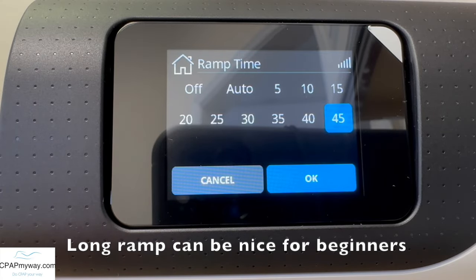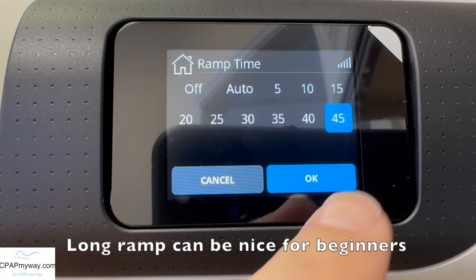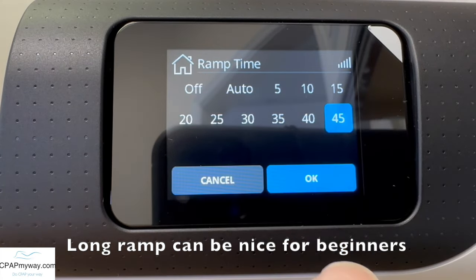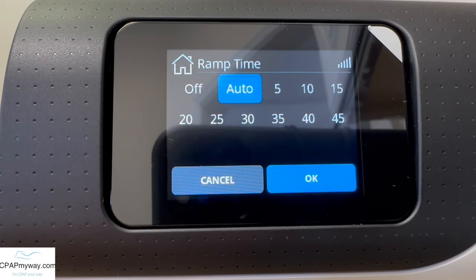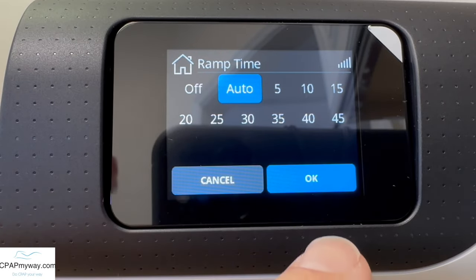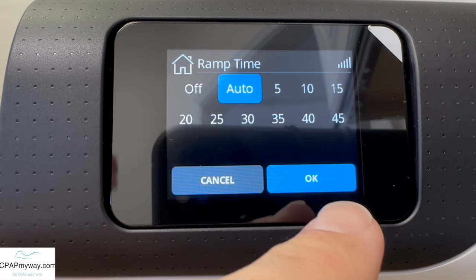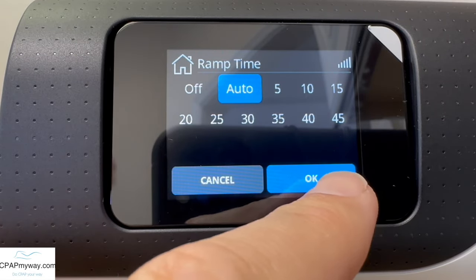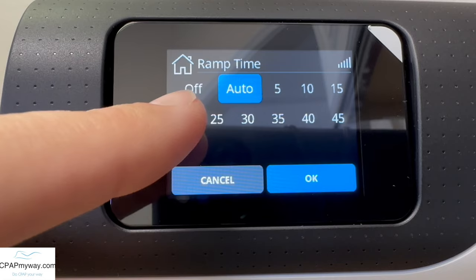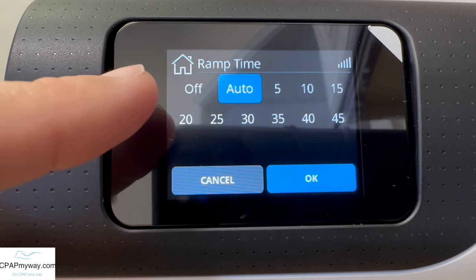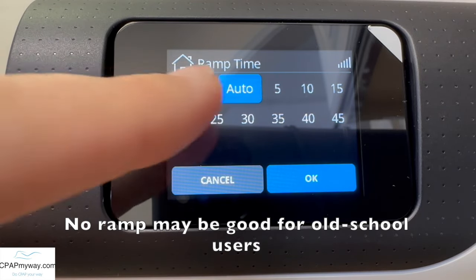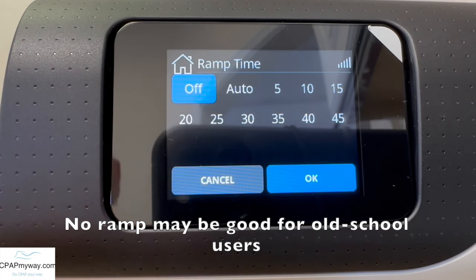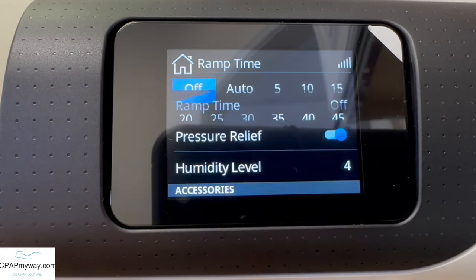If you want a manual adjustment, you can go anywhere from five to 45 minutes. That's the period of time it will take for the machine to go from your ramp starting pressure to your therapy pressure. If you're new to CPAP, a full 45 minutes will be nice, or the auto mode. I recommend at least starting in auto and seeing if it works well. If you're an old school CPAP user and you're just accustomed to the pressure already, sometimes off is the way to go so it just jumps straight into therapy pressure.